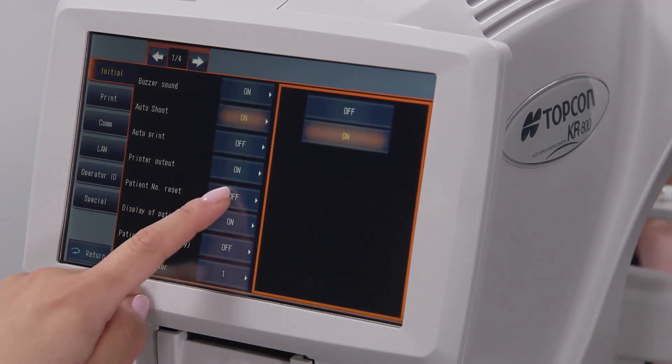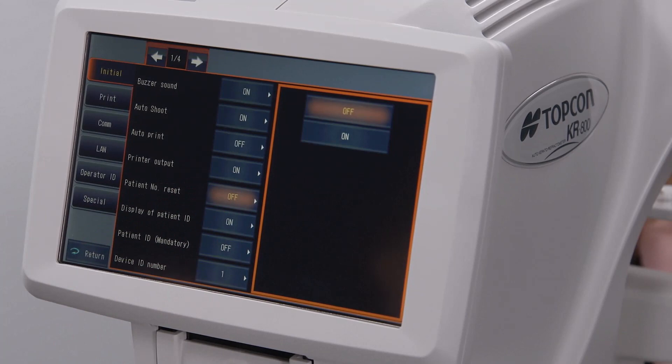Patient number reset determines whether the device will have all patient ID numbers be the same, or whether it will provide a new number for each patient. It's highly recommended to have this off, especially if the device is connected to CV5000 digital phoropter, so that each patient will have their own number on the printout and export to prevent confusion over which results belong to which patient.